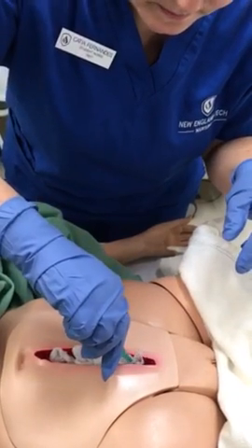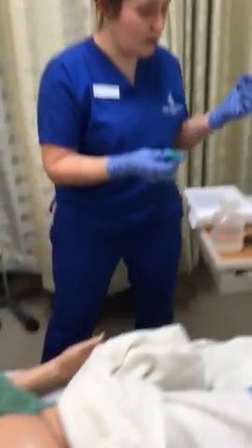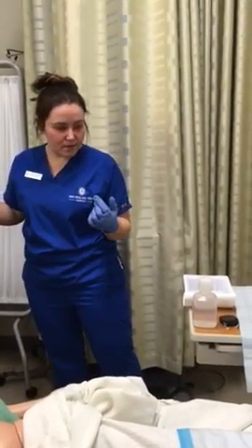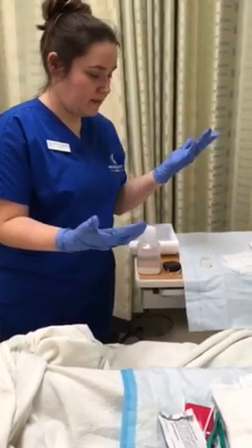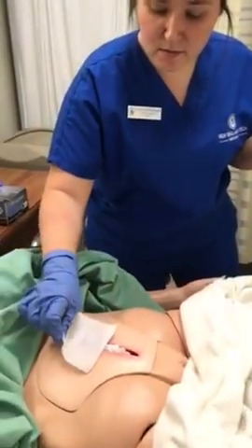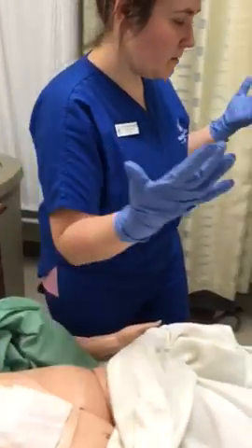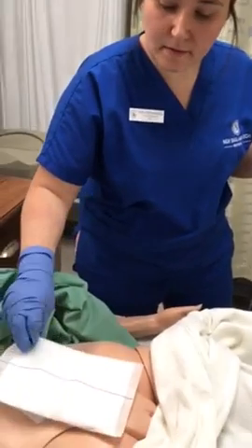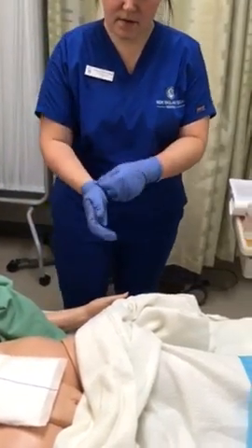Okay. Now that my wound is packed, I can go ahead and, these are dirty, so actually these can go right there. This hand is now clean, this hand remains sterile. Go ahead and cover my patient's wound with 4x4 gauze. And cover the wound with the ABD pad. At this point now I can remove my sterile gloves and the procedure becomes clean.